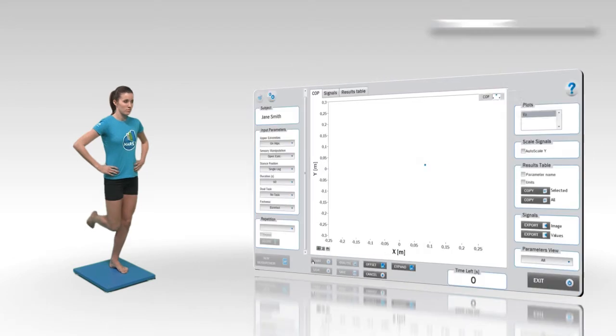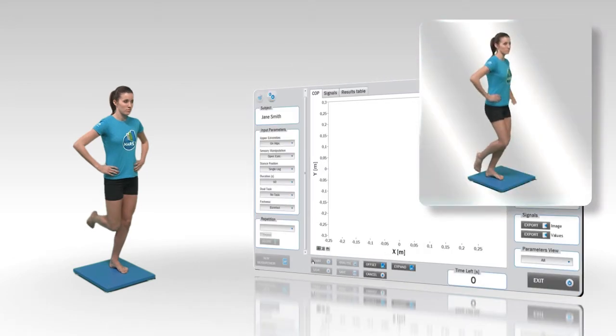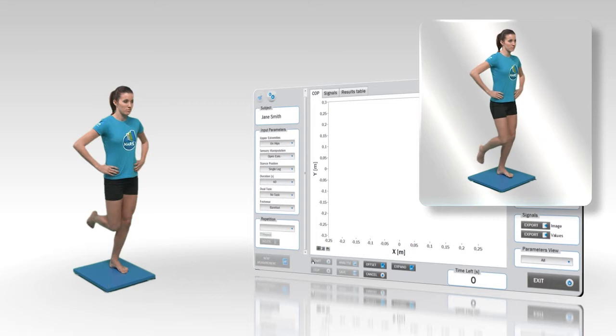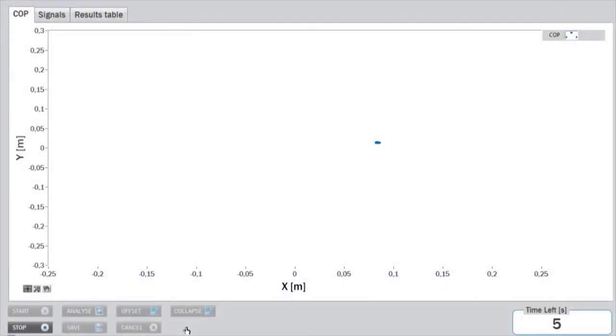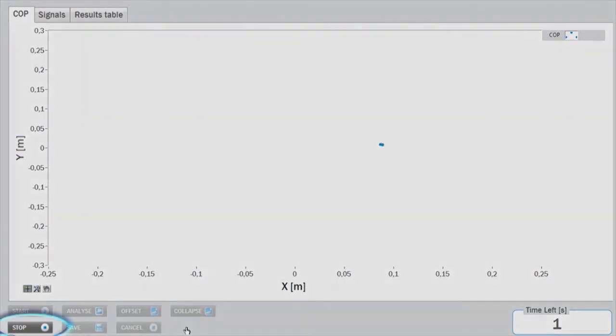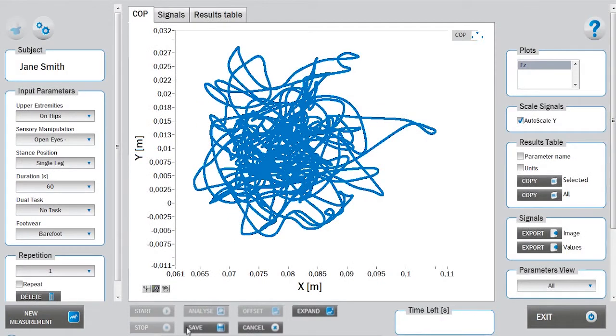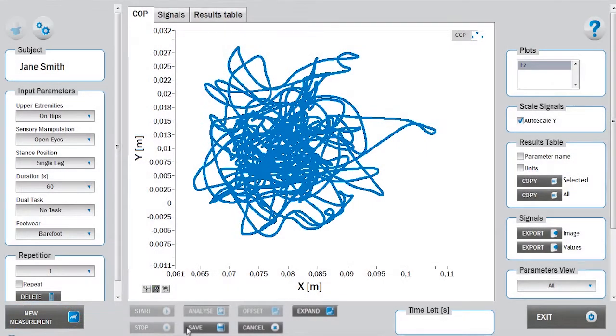If the subject falls or moves, the measurement needs to be repeated. The measurement stops automatically after the predetermined time period. It can also be stopped manually by pressing the stop button in the lower panel. The measurement can be repeated by clicking on the new measurement button and not saving the previous repetition.